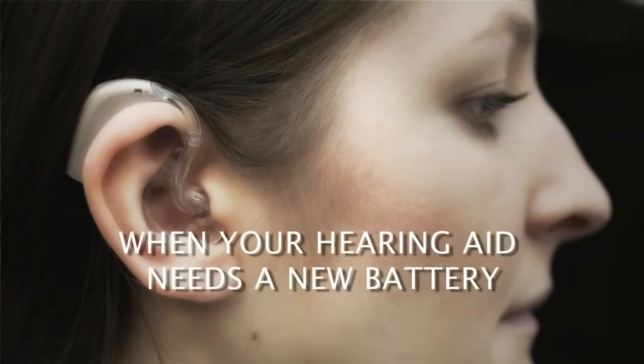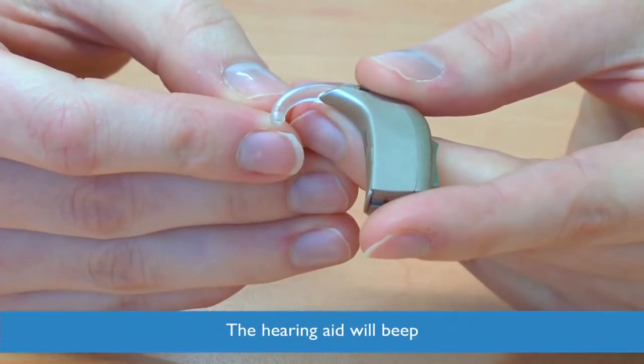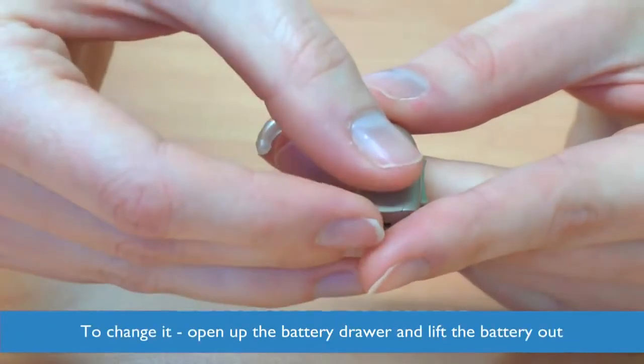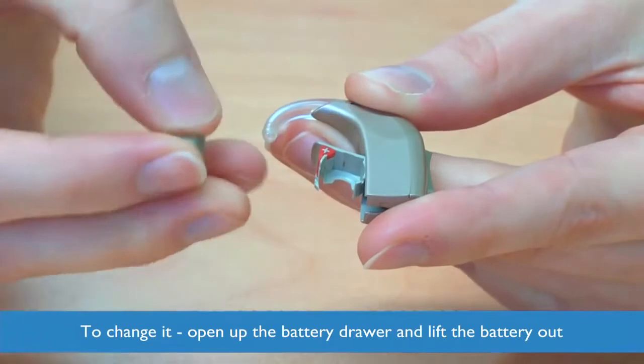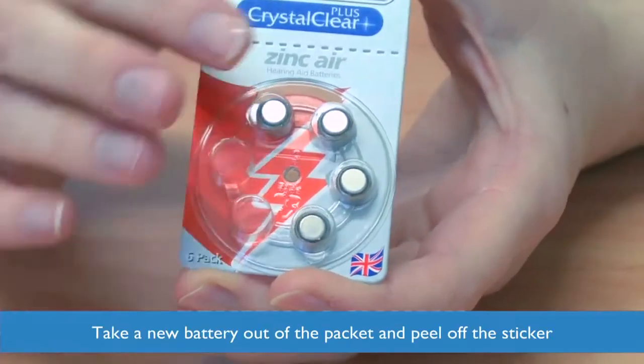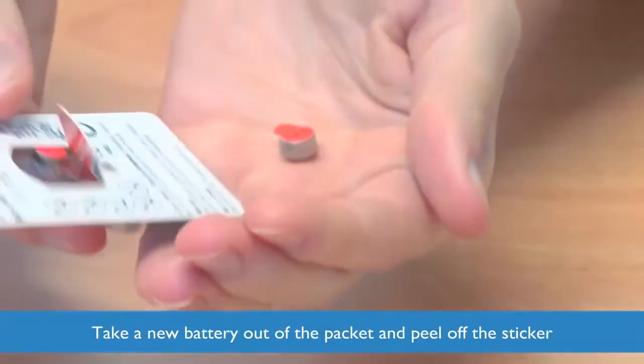Changing the battery on your hearing aid. When the battery in your hearing aid needs changing, the hearing aid will beep. To change it, open up the battery drawer fully and lift the battery out. Take a new battery out of the packet and peel off the sticker.